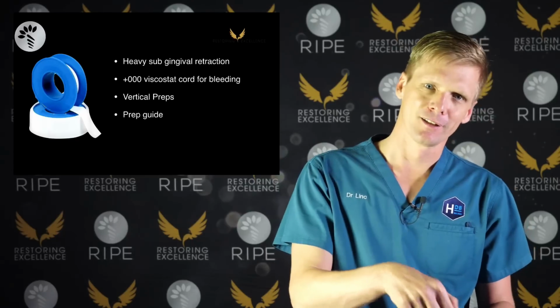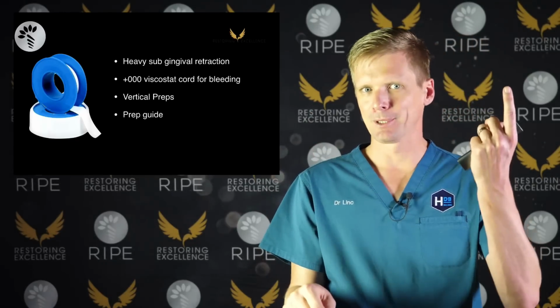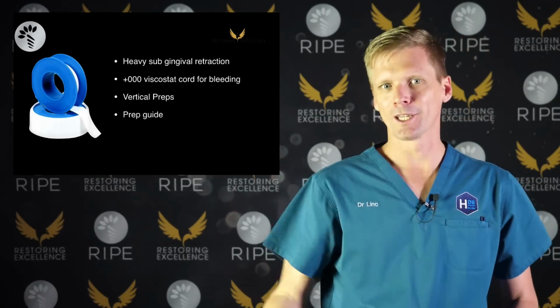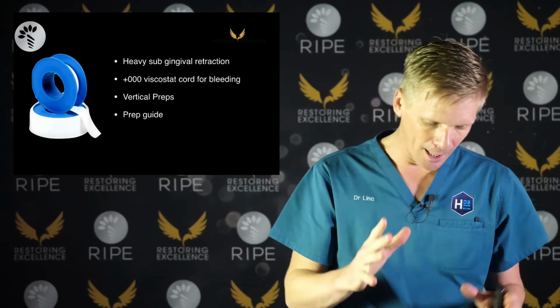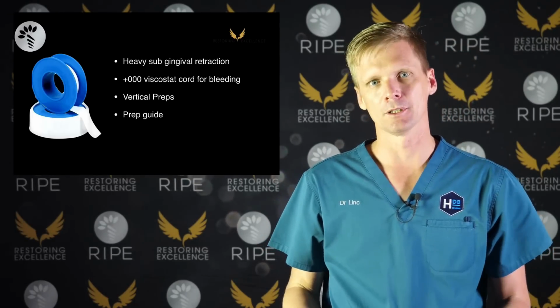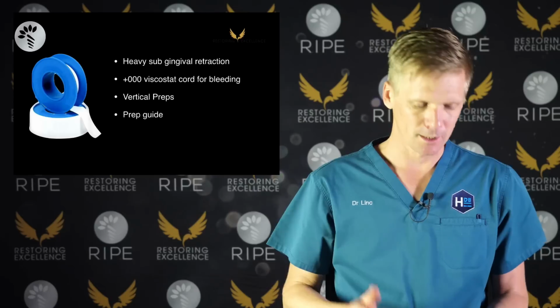Okay, you can push it in, and then you push the next spot and the first bit pops up and says hello, okay, and then you push that one down. It's like whack-a-mole. Doesn't matter where you hit it, it pops up somewhere else. With apologies for those of you who have a pet mole and are upset about it being whacked.